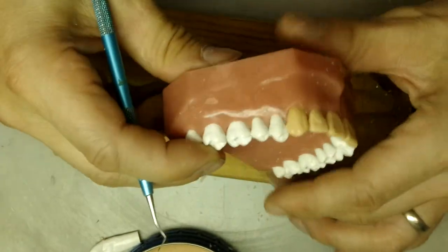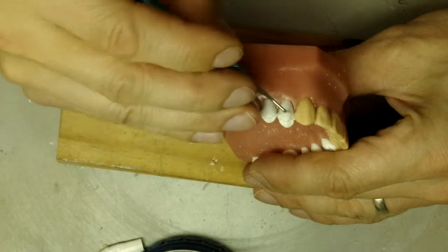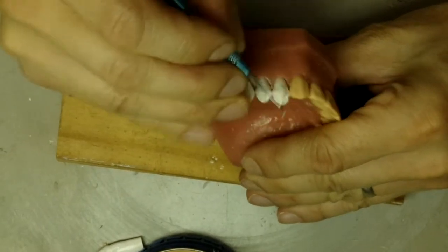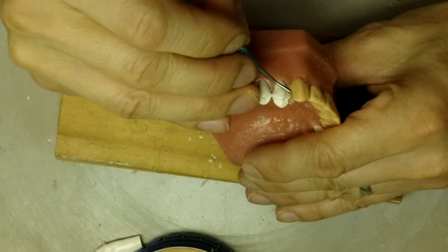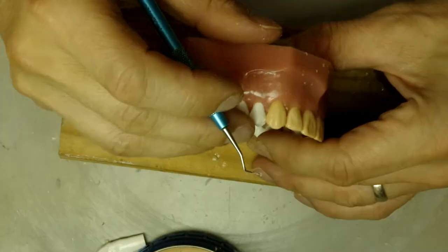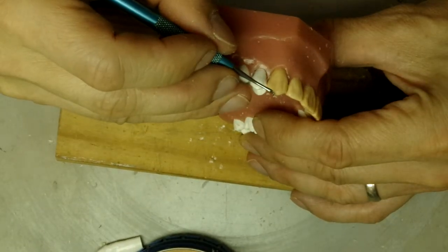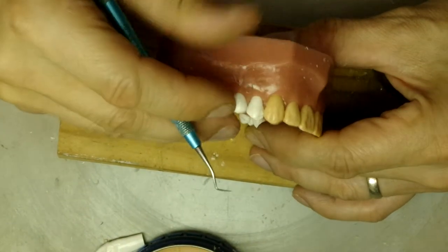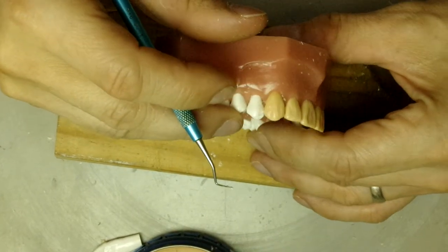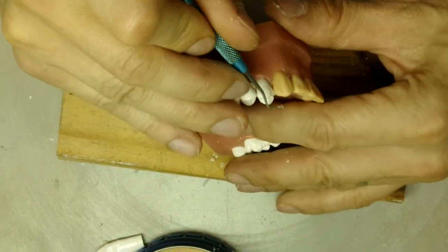So that is basically our canine. I kind of like to have this cusp tip not so much in the middle, so I'm going to move it slightly to the front, or mesially.